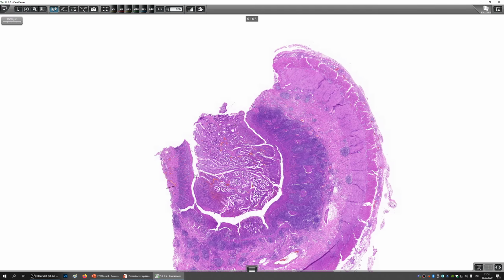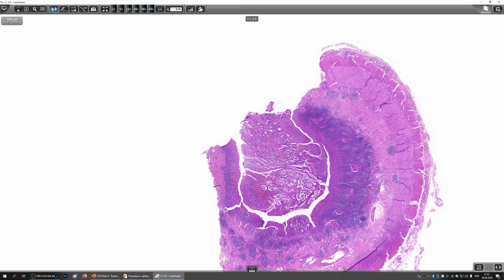So you can see that there's a very tiny lumen remaining, so this patient probably developed ileus because of the blockage of the passage of intestinal contents. So the first operation that these patients have to endure is resection of the terminal ileum, and then they are prone to developing strictures and stenosis in other parts of the gastrointestinal tract, so they usually during their lifetime undergo multiple operations.